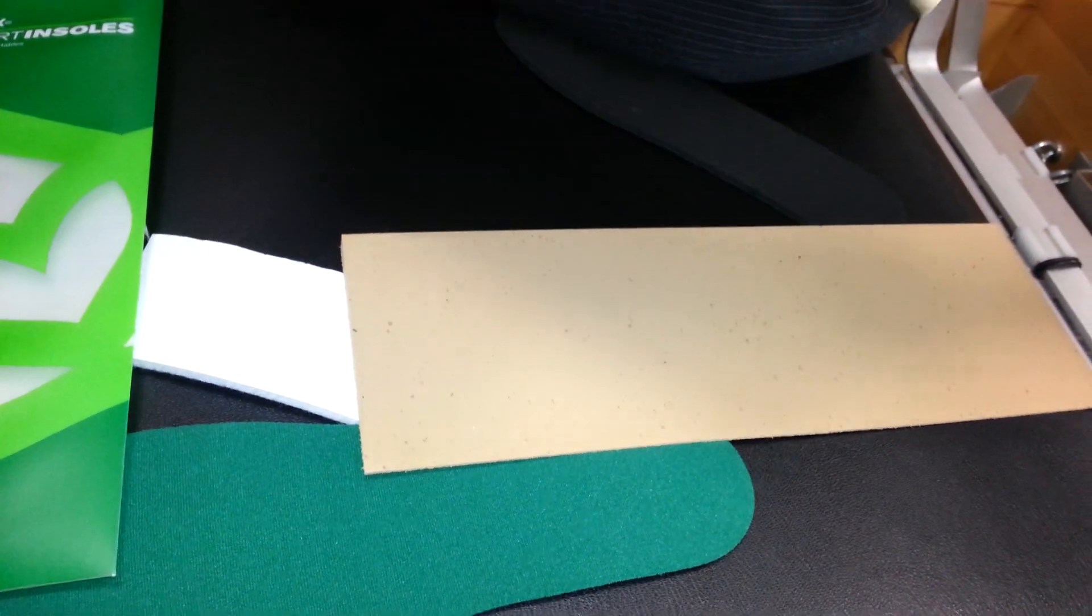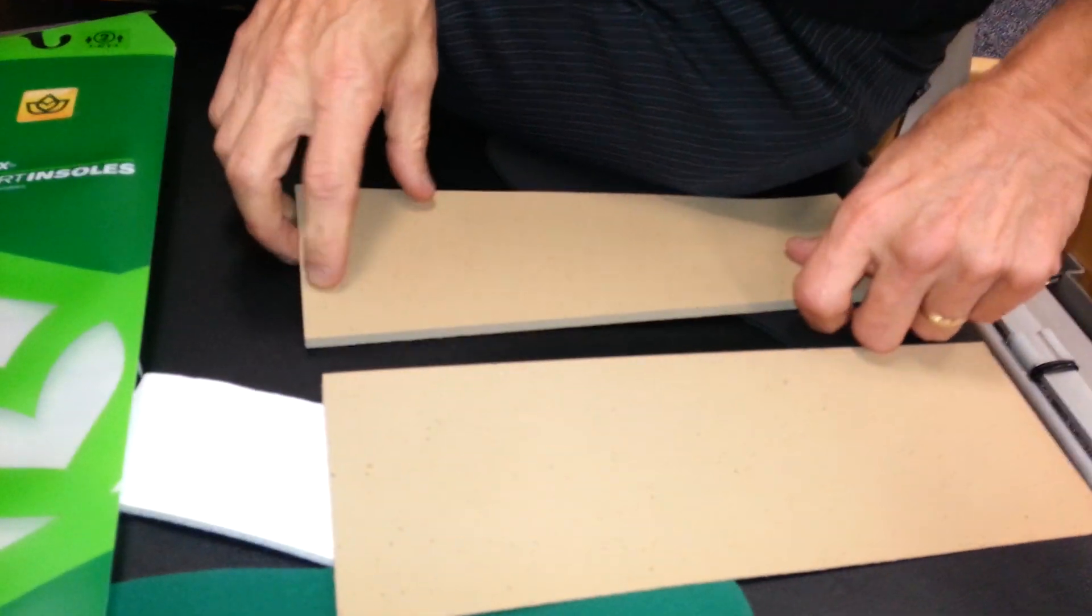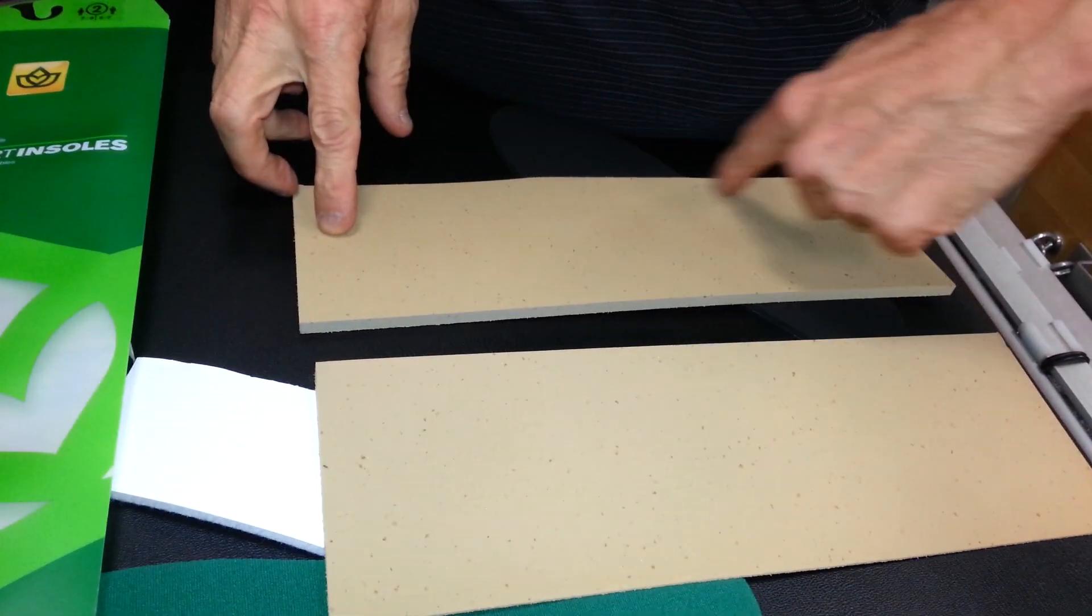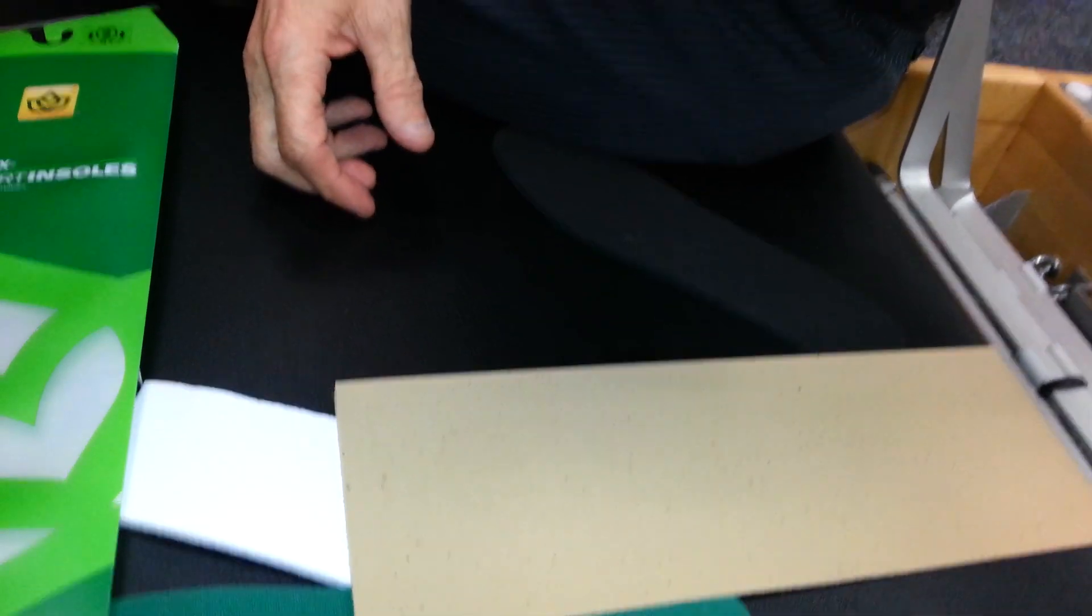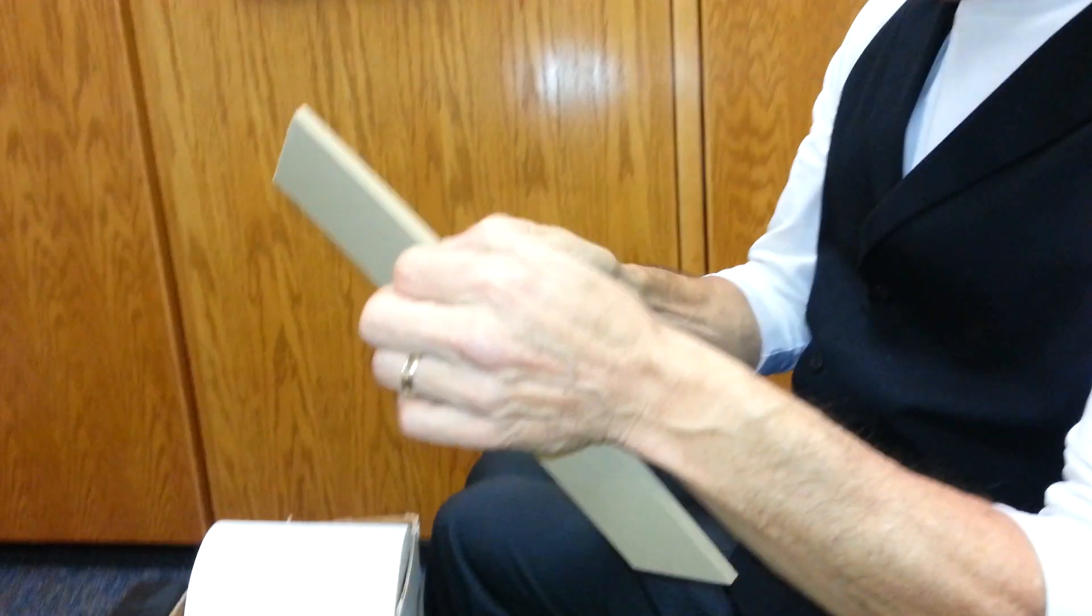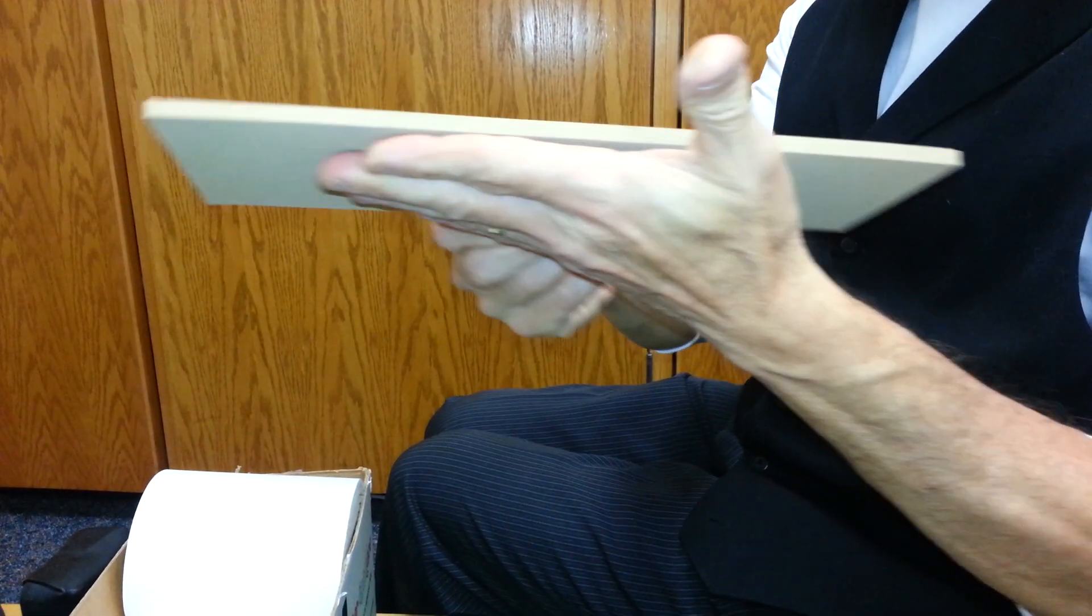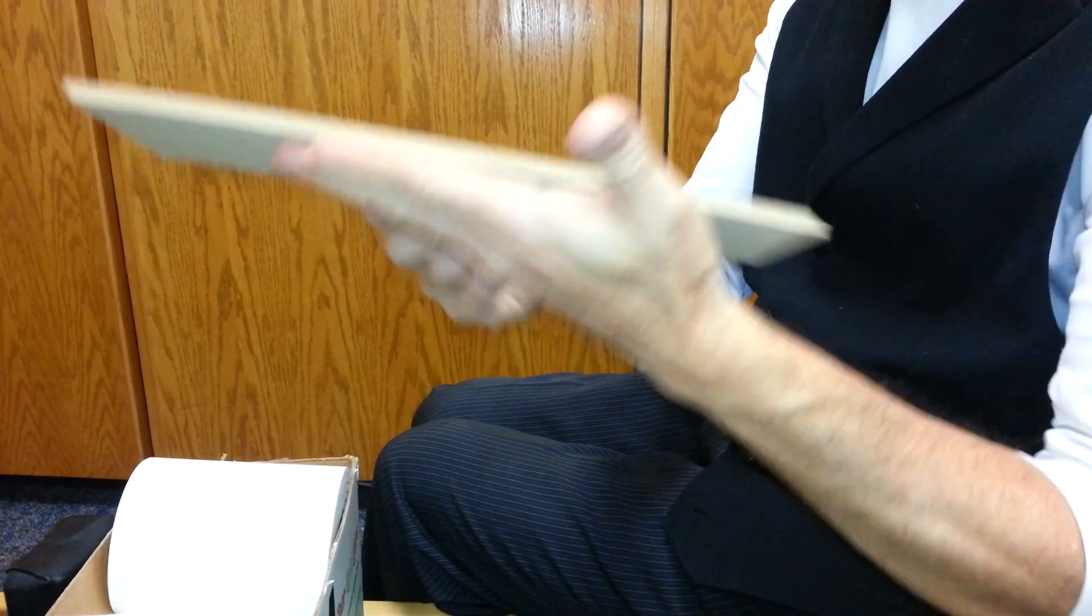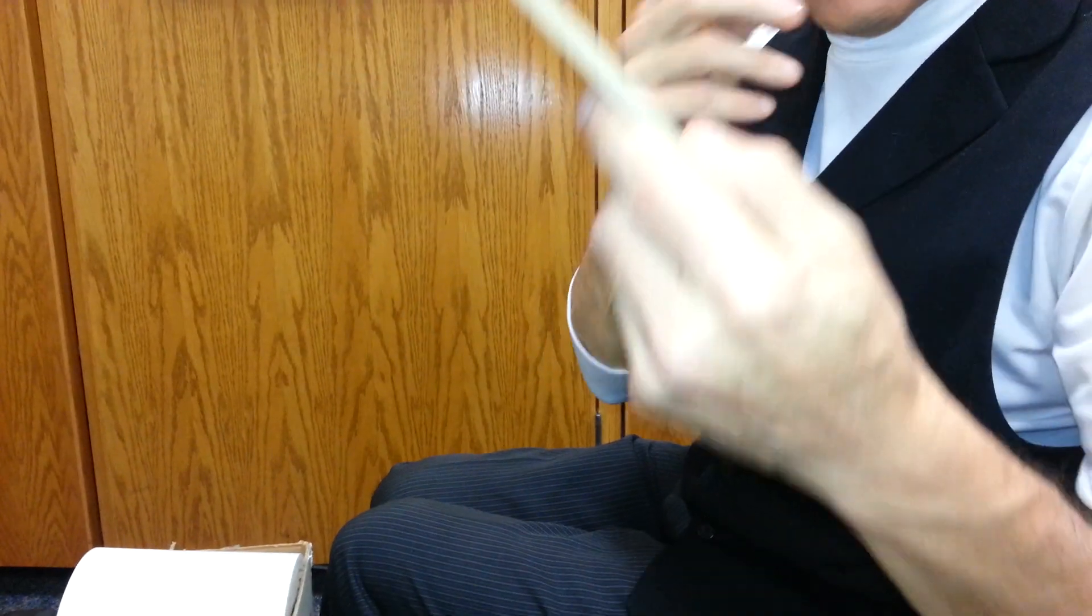There's kind of two sides. There's a rougher side and a smoother side. Smoother side up. She'd do her whole foot on this. Then she'd just stick these in her shoe. And what that does is it throws her, it actually puts a little more pressure, apparently, on that sesamoid side. But it throws the weight outside so she's not... she's really walking more on the outside of her foot. Because if she pronates, this is what would work to help that.